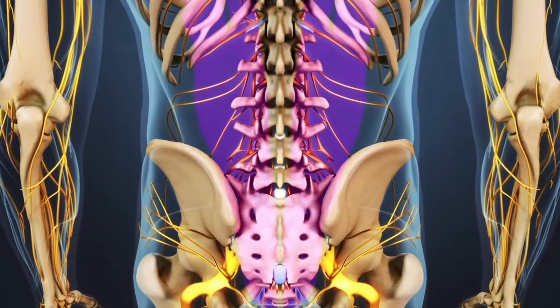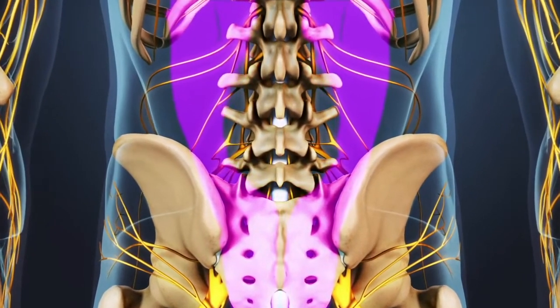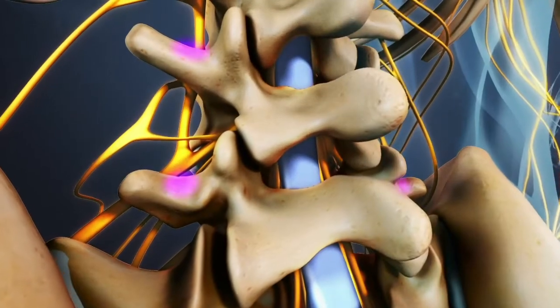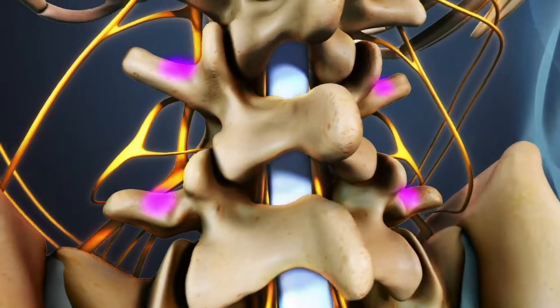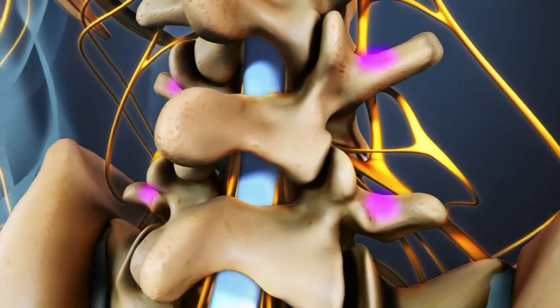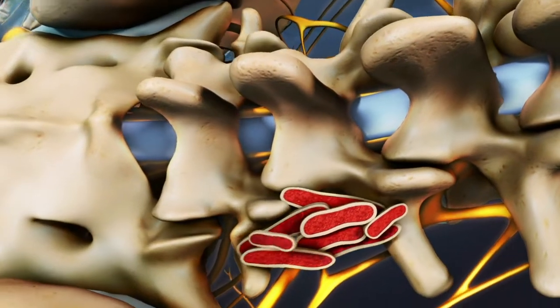The back muscles that attach to the transverse processes are then lifted up, exposing the posterolateral area and creating a bed for the bone graft. The posterolateral area is used because it has a high concentration of blood vessels that help the body generate the new tissue needed to create the bone fusion. The bone graft morsels are then laid out on the exposed posterolateral area.